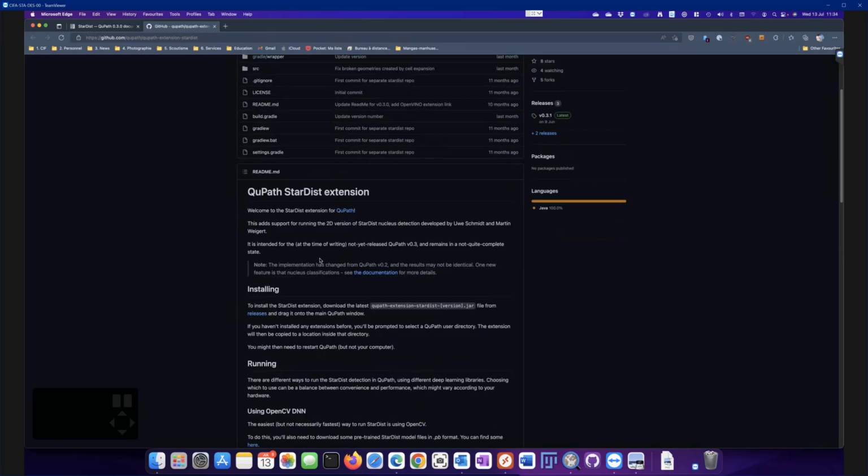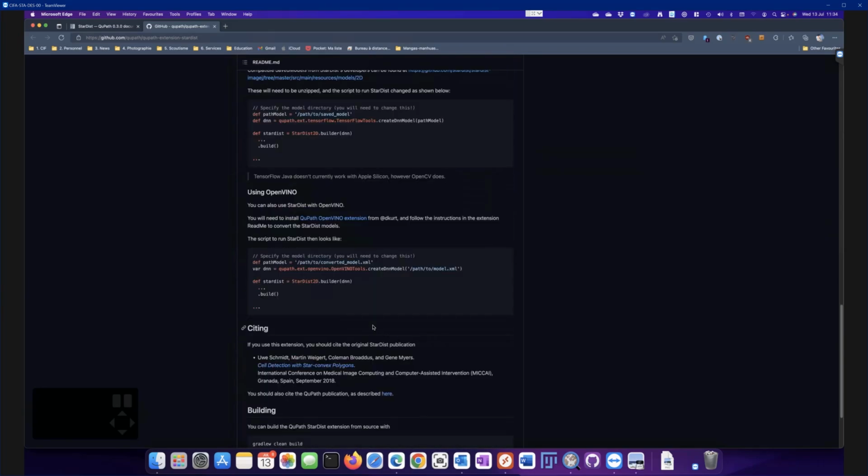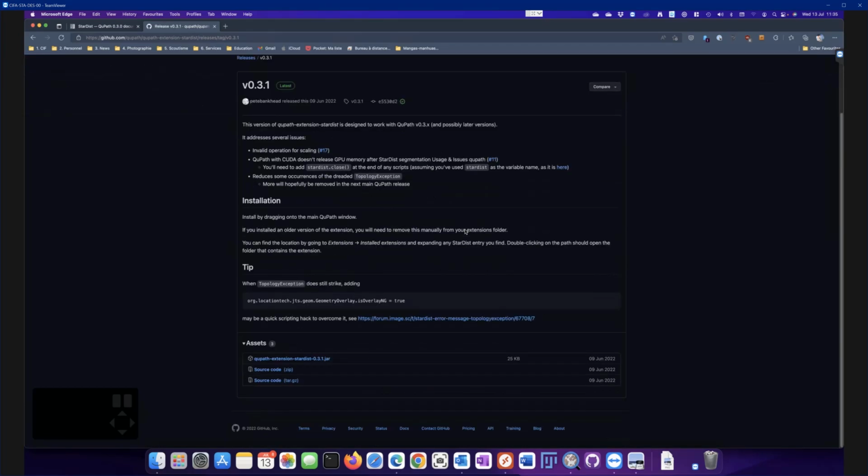Where is it? Oh, they have changed it. So normally you have to go to the release page. Where is it? Release here. It's the latest. And you can now download this .jar file. Let me just click this here. I will save this.